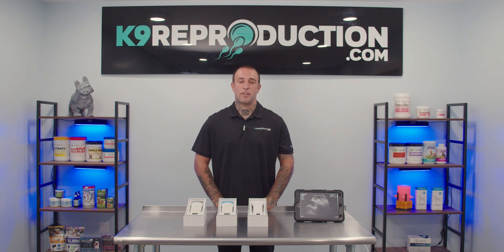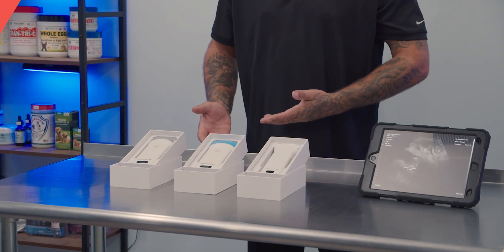Hey guys, this is Travis with K9Reproduction.com and today we're going to take a look at an exciting new line of wireless ultrasound probes by K9 Quick Scan.